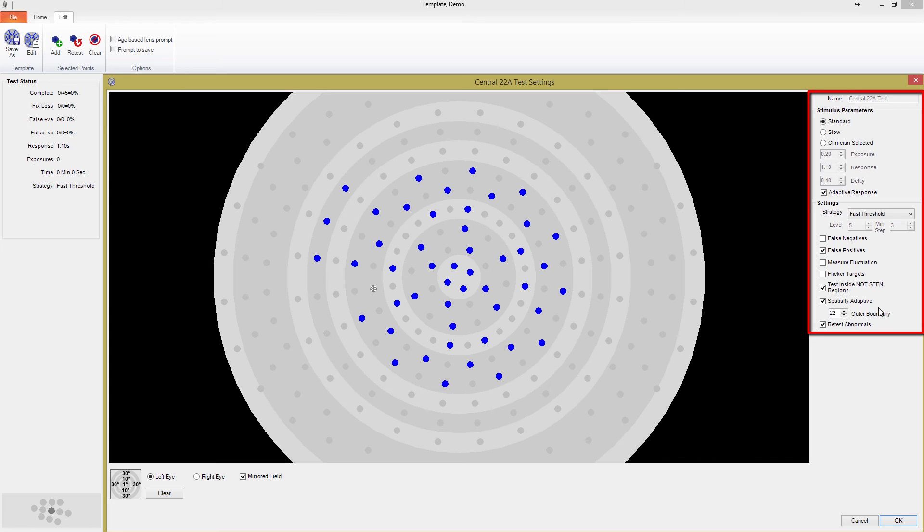This is repeated for every point, quickly expanding around areas of localized defects. In this way, you can build a very sparse field for quick screening, but be confident that any defects will be sufficiently examined.